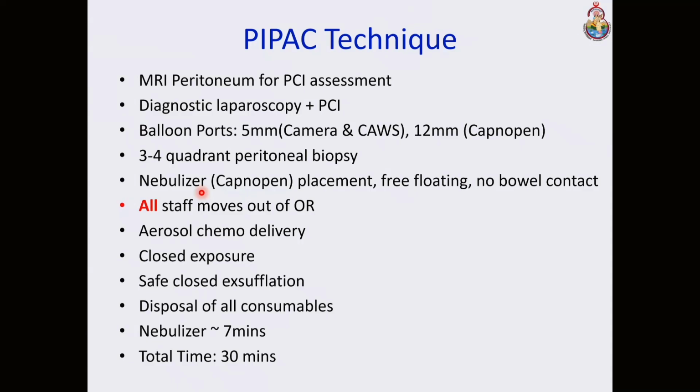Once it is all set, all staff moves out of the OR and aerosol chemo delivery is done either with a remote control injector, or the wire should be such that it can come out of the theater. And as for anesthesia, as Dr. Ray was discussing during his surgery, most of the time it is not inhalation but IV anesthesia that is used, so that everything can be controlled outside the OR.